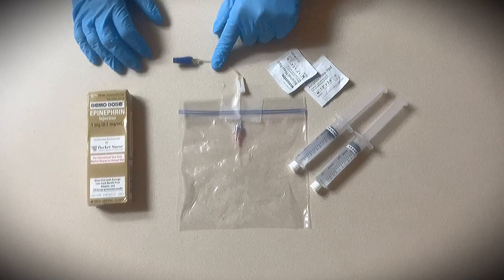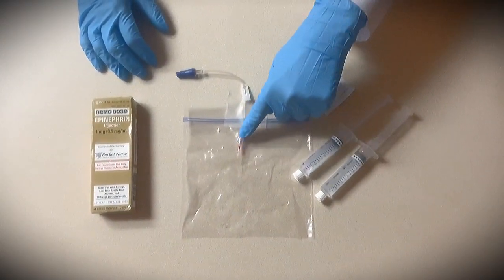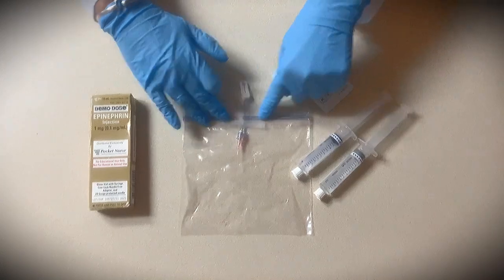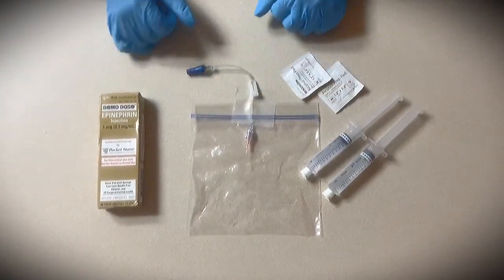I've taken the extension set and the angiocath — just the catheter itself — connected them together, put them in the ziplock bag, sealed it, and taped it down to the desk so that this is stable like as if it was an IV.